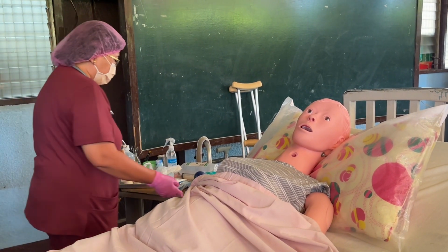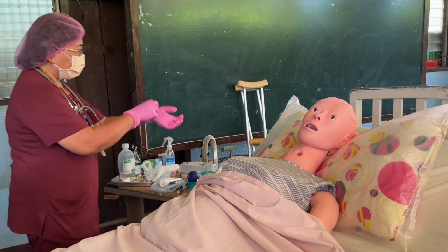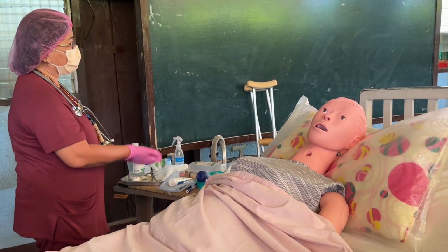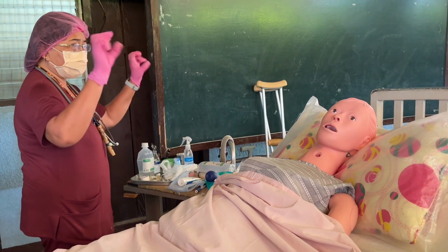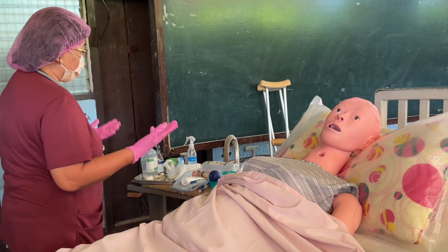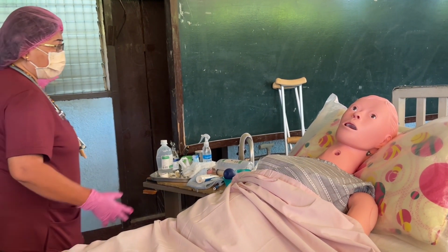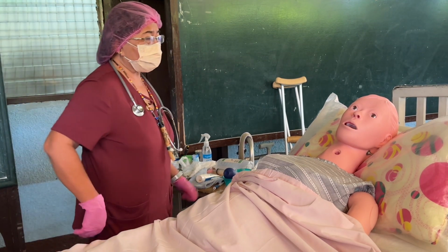So, everything's prepared now. Check everything, then do glove to glove, skin to skin hand washing, hand sanitizer, and then I change my gloves with new clean gloves. Then carrying everything into the patient room. Knock again. Ma'am, I'm back. Shall we start with the procedure, ma'am?